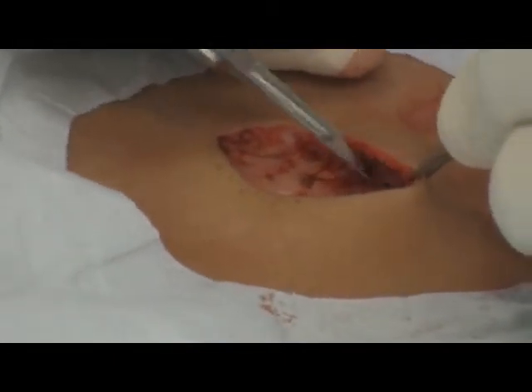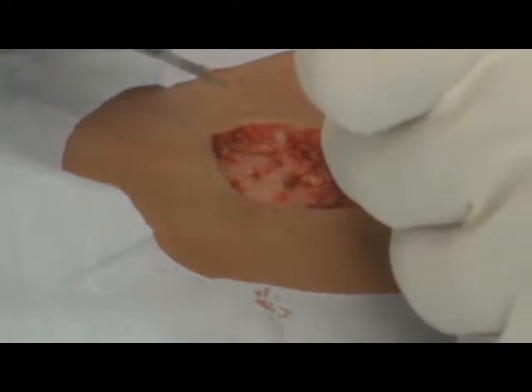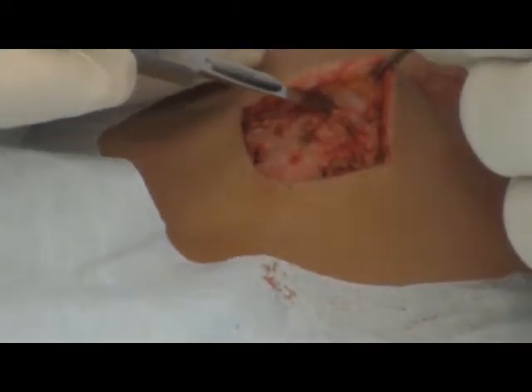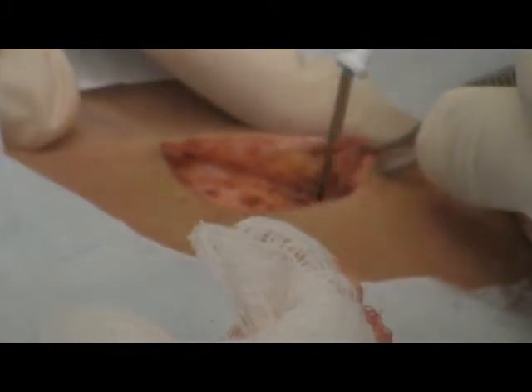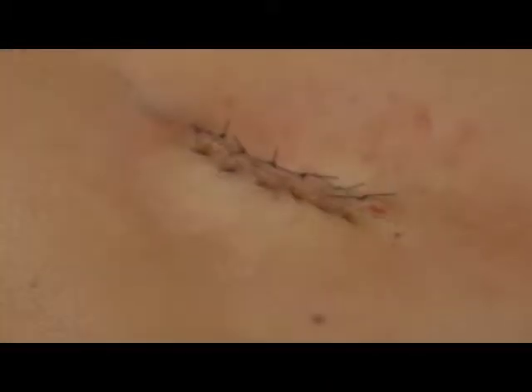Next, we will proceed with the undermining through the fat layer of the wound, in order to bring the skin together without too much tension on the sutures. If the undermining creates additional bleeding, electrocoagulation is easily achieved in seconds upon contact of the A804 electrode to the bleeding point. A final inspection of the surgical site shows the efficacy of the ARIN 940. The wound is completely sutured, and no bleeding is present.